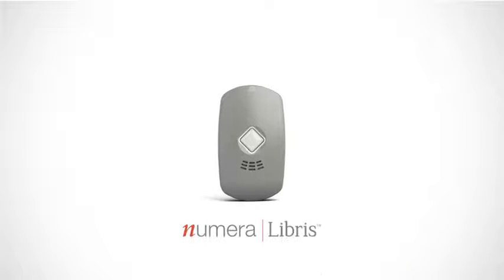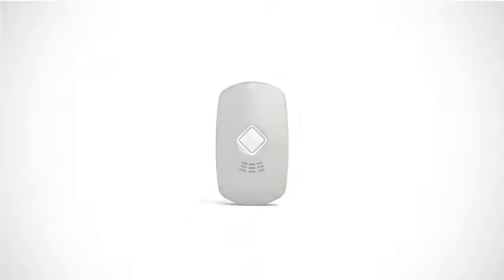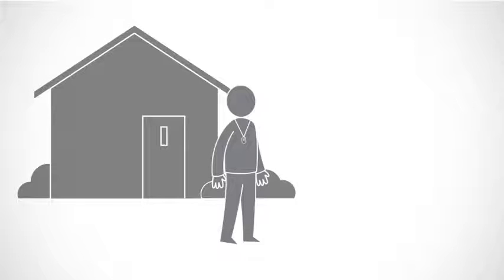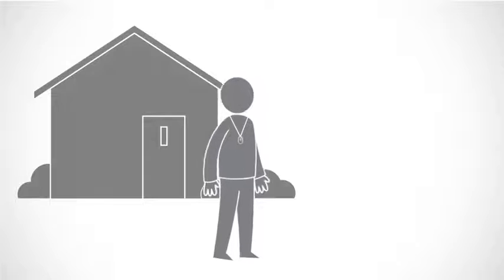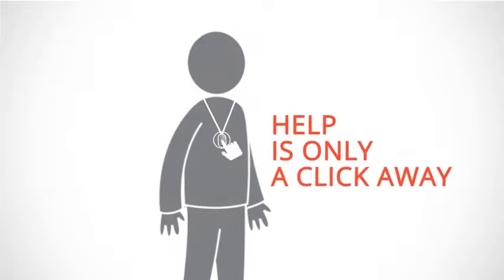Say hello to Numera Libris. Libris is a mobile PERS device designed for active older adults who want to continue to live independently, with peace of mind that comes with knowing help is only a click away.